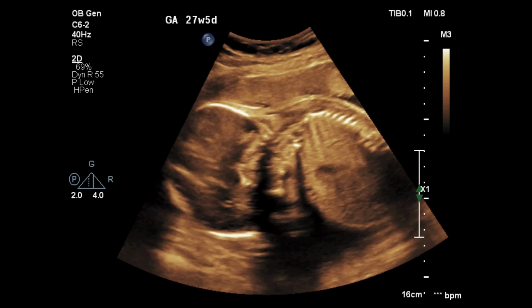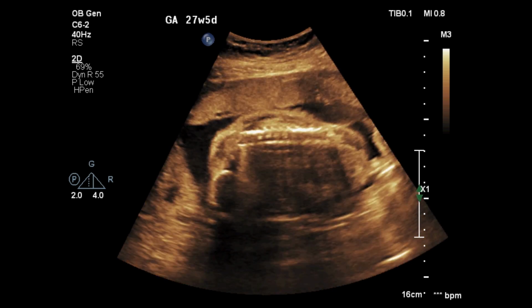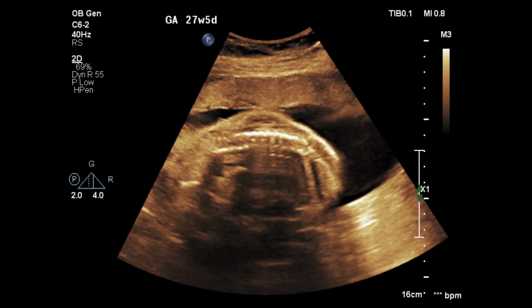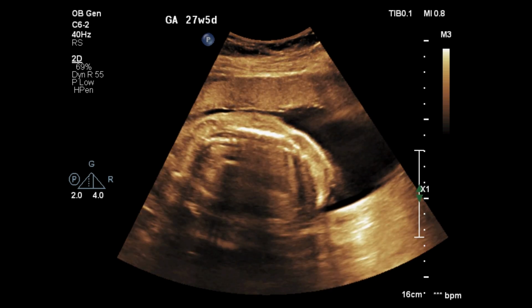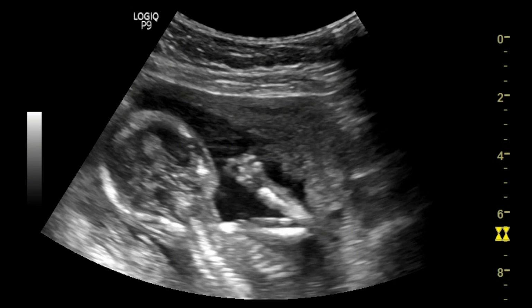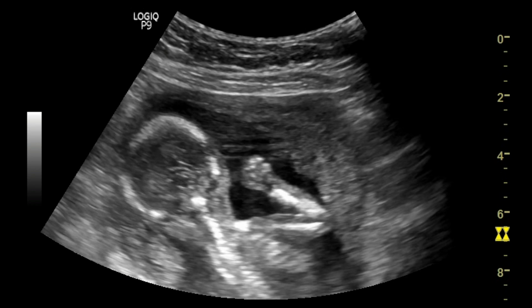Here a flexed spine. Slight flexion, extension flexion is going on rapidly. I don't know whether you could understand or not. Look at the fingers. Can you see tone here?